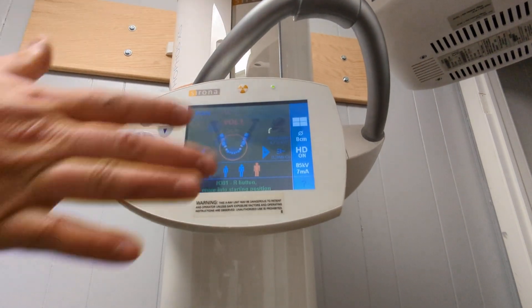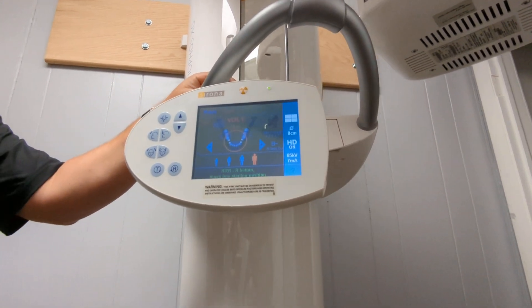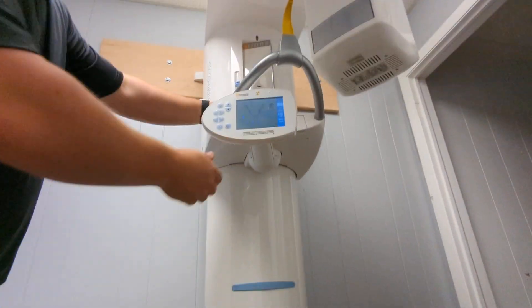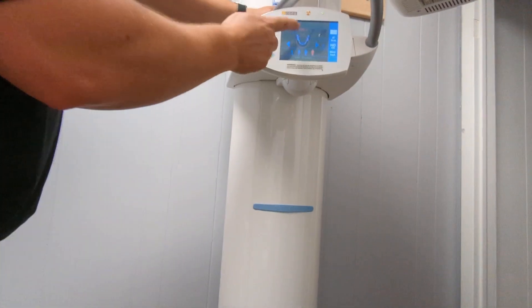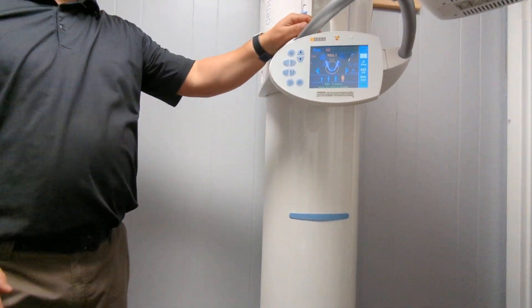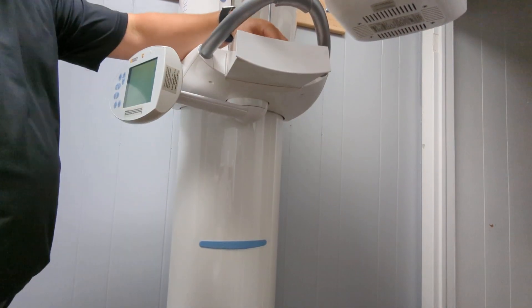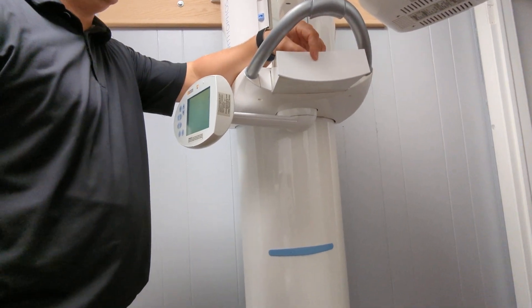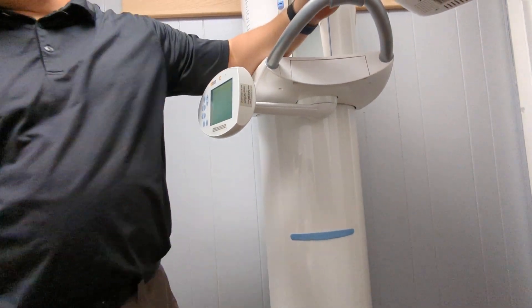Once you have this set up, you're going to get this part set up for what you want to do first before you put the patient in. Most machines are backwards — you do the patient first. There's a chair behind you. You also have a drawer right here on the unit to put accessories — stash your stuff, whatever you want to do. Perfect spot.